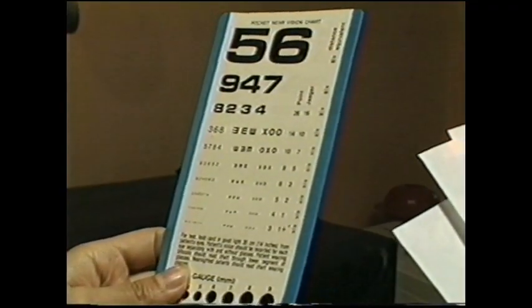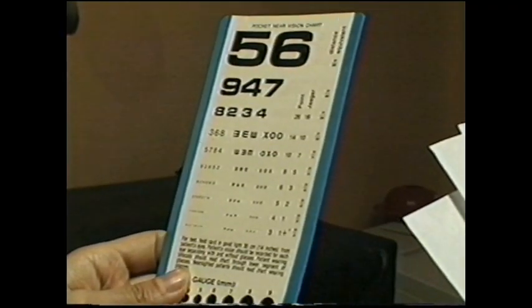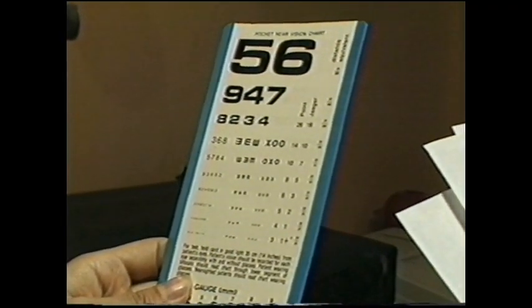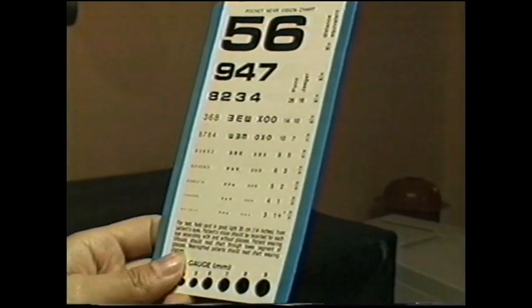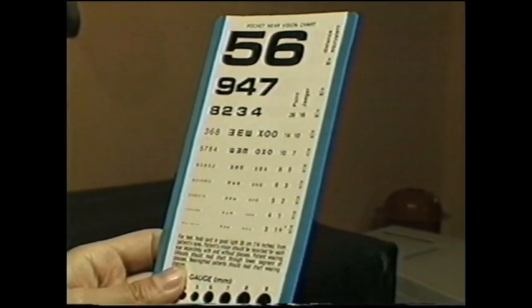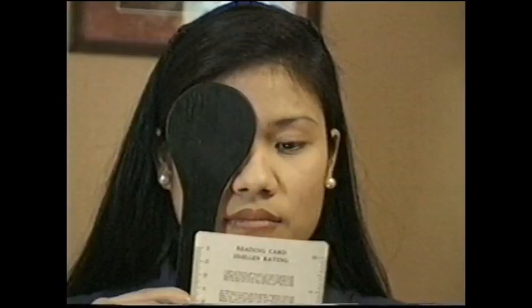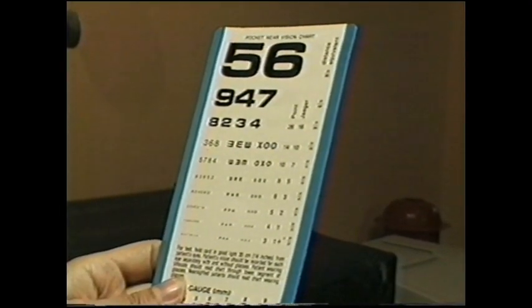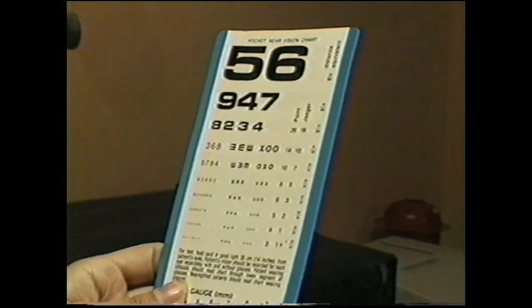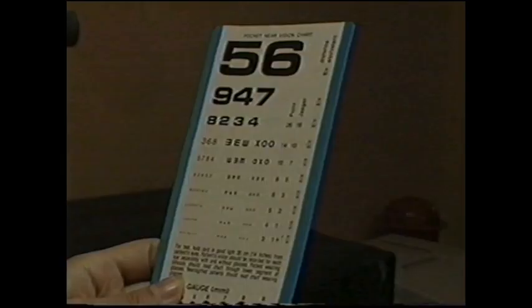Number 3. Ask the patient to say each letter or read each word on the line of smallest characters that are legible on the card. Number 4. Record the acuity value for each eye separately in the patient's chart. Number 5. Repeat the procedure with the right eye occluded and the left eye viewing the test chart. Number 6. Repeat the procedure with both eyes viewing the test card. Number 7. Record the binocular acuity achieved.